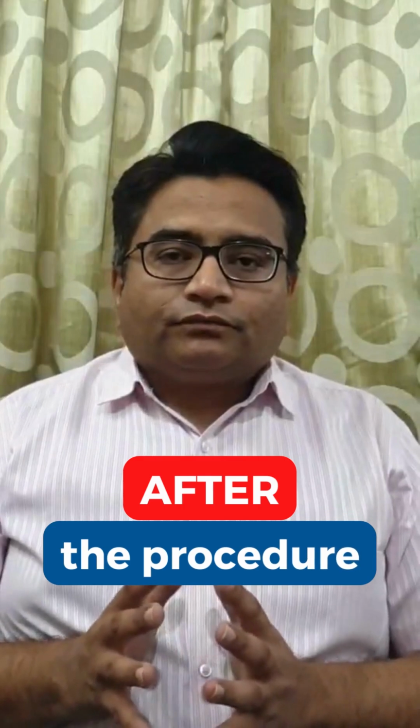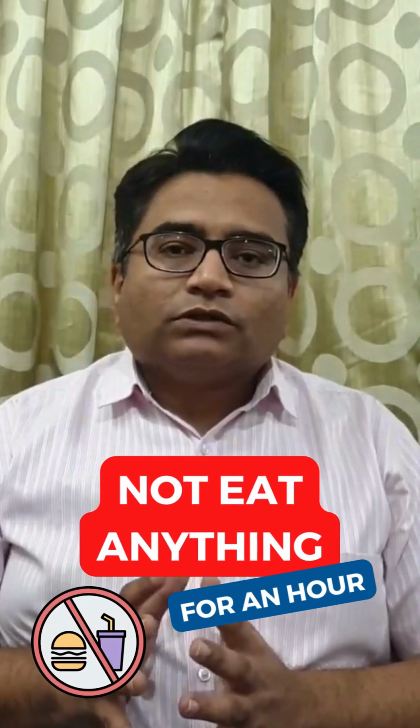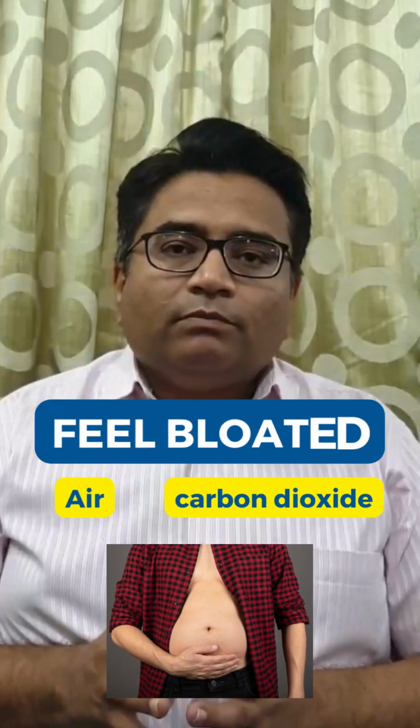After the procedure, you will be asked to stay nil orally, that is not to take anything by mouth for a certain period of time, say 1 hour, and you may experience a little bit of sore throat. Plus, you may feel a little bit bloated because we have inflated your stomach with air or carbon dioxide. But gradually over a period of a few hours, you will be perfectly alright.